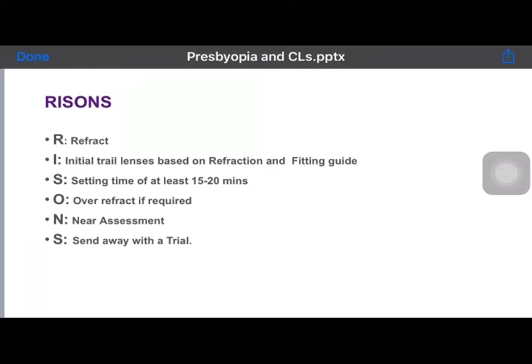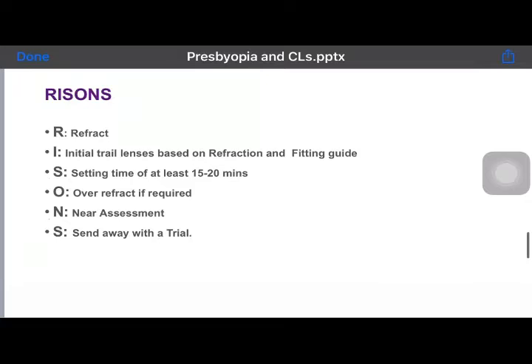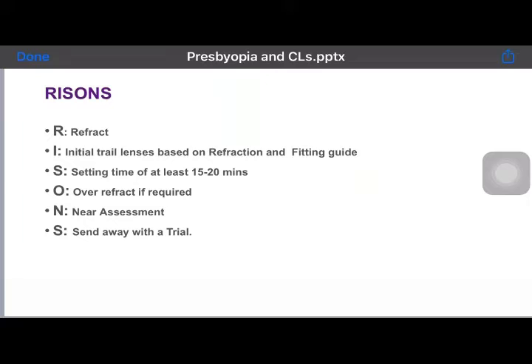And after 15 to 20 minutes, check their vision. Now, a good part is when you make your patient wait in your clinic for 15 to 20 minutes, they would either look into their mobile or roam around your clinic looking at sunglasses and frames. If they are doing this, then you should be very happy, because the multifocal lenses are working in their eyes. If they're not doing any of it, they're just sitting there with no clues and looking here and there, that means you might need to over-refract with the multifocal lenses. It might not be working in their eyes. So do follow what your patient is doing when you have asked them to wait for 15 to 20 minutes before checking the first vision.